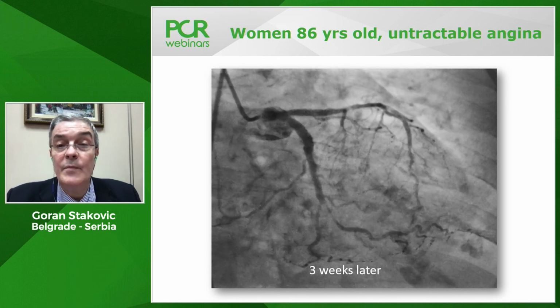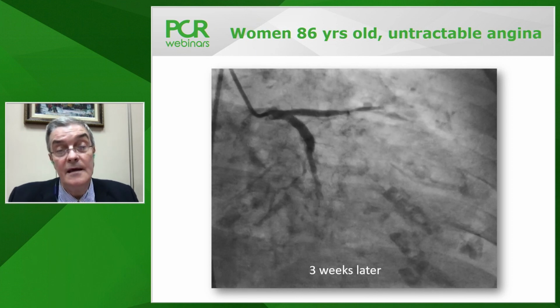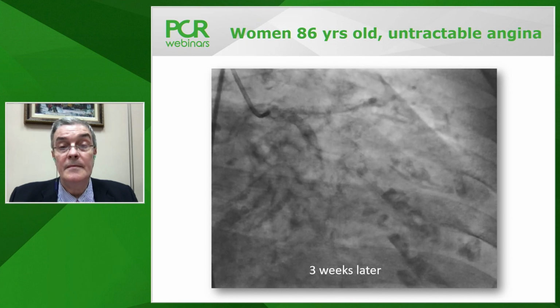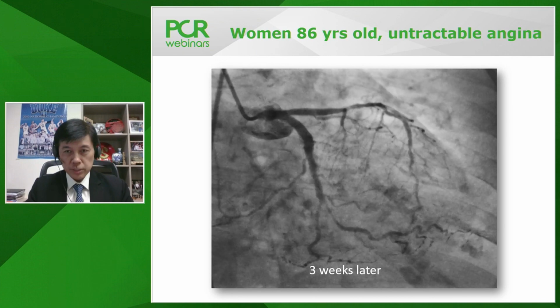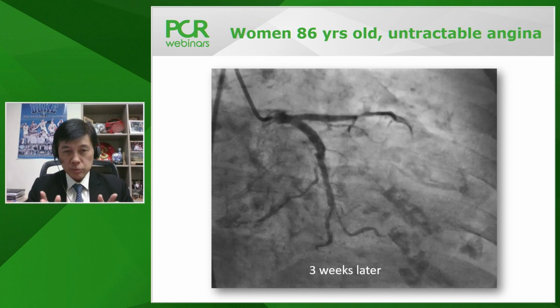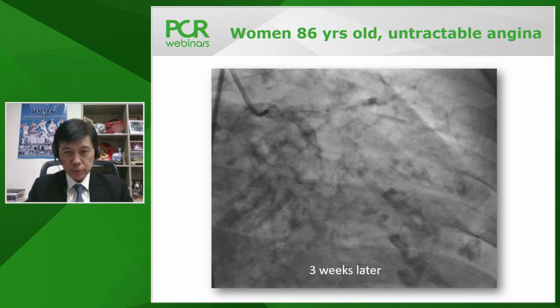And I don't know, maybe Prof. Tan, now you can express your perspective, and then Thierry, before we move to the second case. Goran, I agree with everything you have said. I just want to add that many a time the strategies for intervention in bifurcation lesions are also morphology dependent. It depends sometimes on the angulations of the two vessels to decide what is the best strategy.